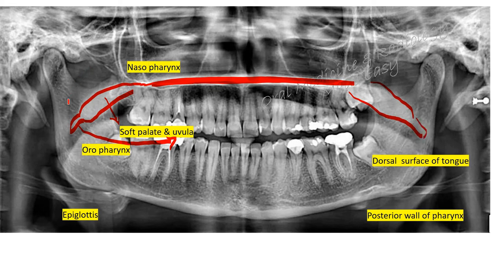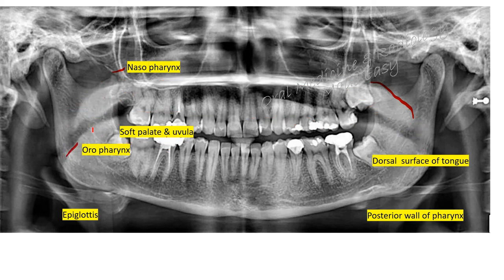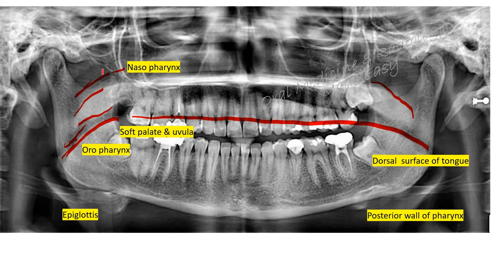The radiolucent shadow seen here is the nasopharynx, and this shadow is the oropharynx — that is a space, so it appears as a radiolucent area. Below the palate you can also see a faint radiopaque shadow, and that is the dorsum of the tongue. Between the dorsal surface of the tongue and the soft palate is the oropharynx, and above the soft palate is the nasopharynx.